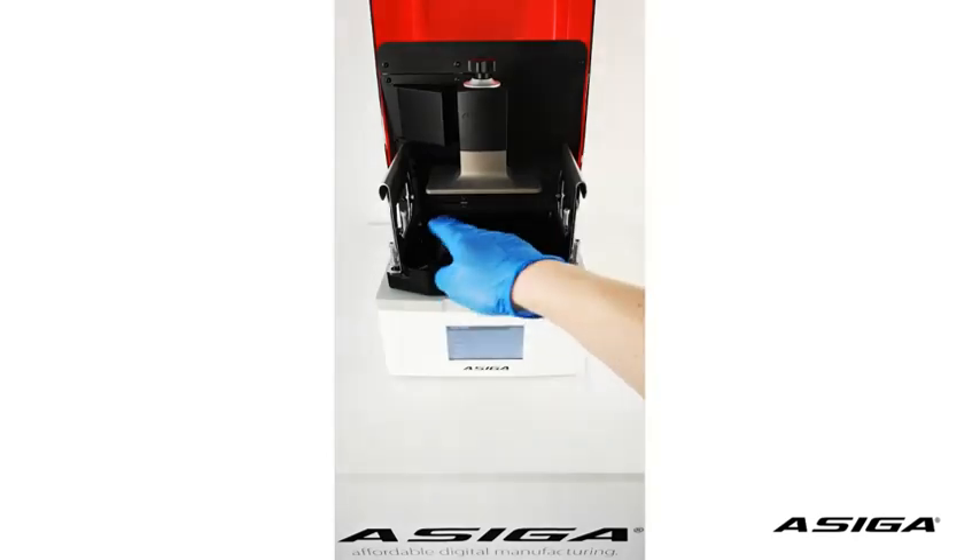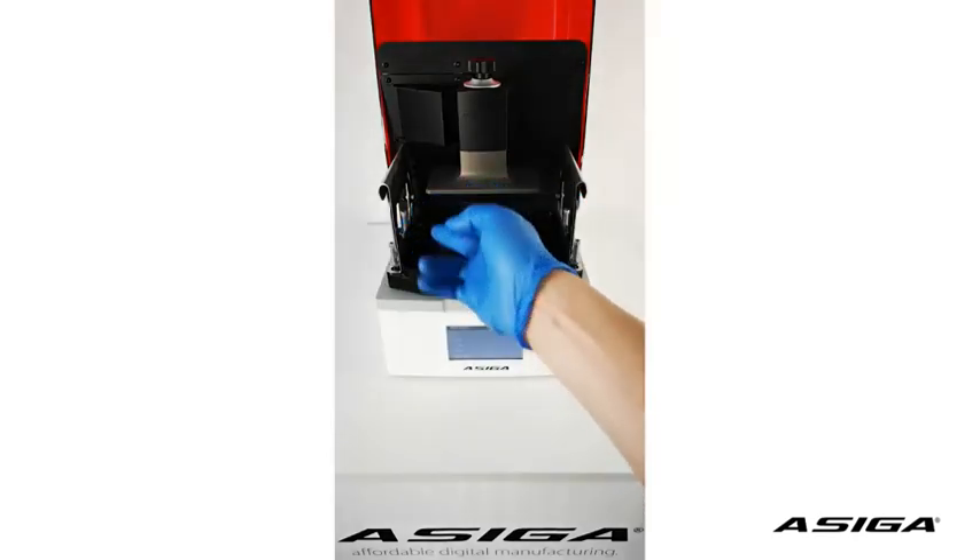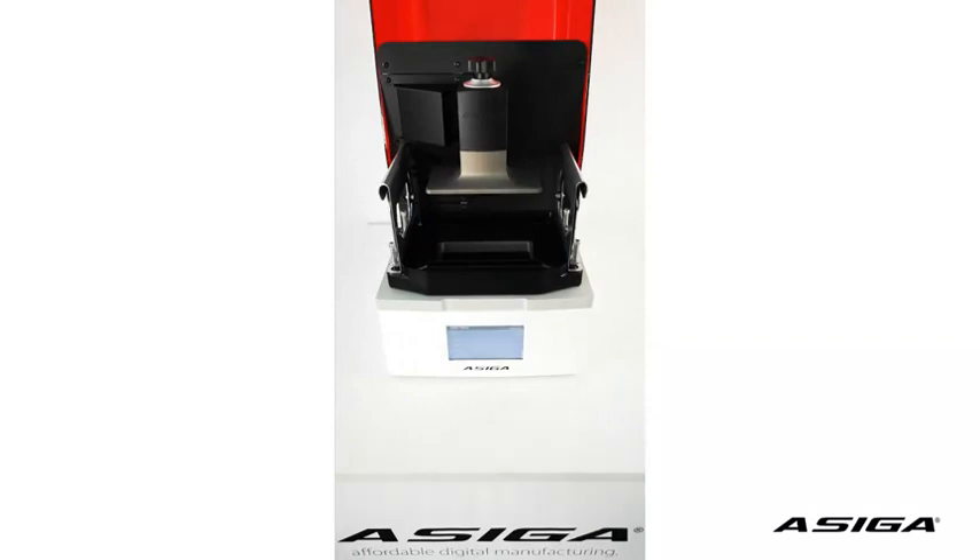Before you start, make sure that your glass is perfectly clean and your platform is perfectly clean. What you need is a piece of paper — thickness should be 100 micron, like a standard 2D printing paper.